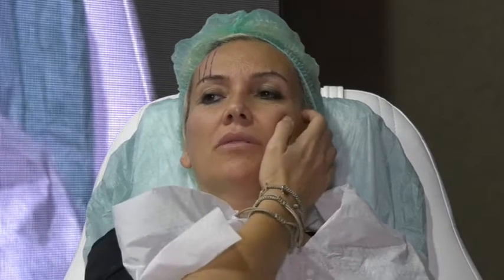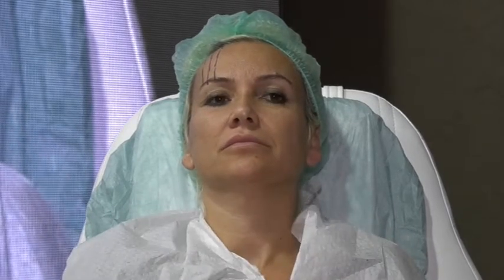For what purpose? Why do I go to this other zone? Because I want fixation. Because this is a zone, from one zone to another zone. That means I have achieved lifting. Because with this type of threads, you have to move the laxity from one zone to another aesthetic zone. And you have to have a fixing and anchoring point. We always have to remember that.